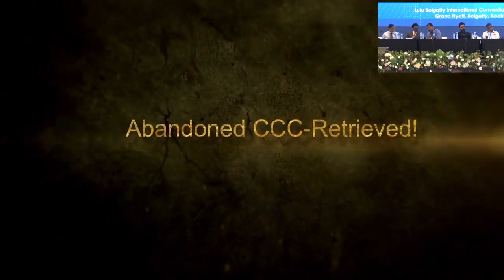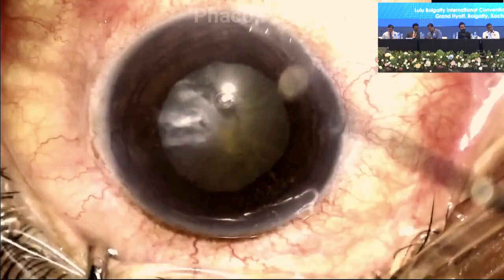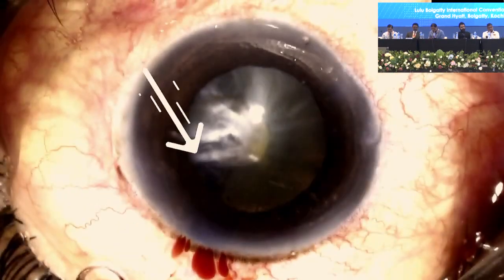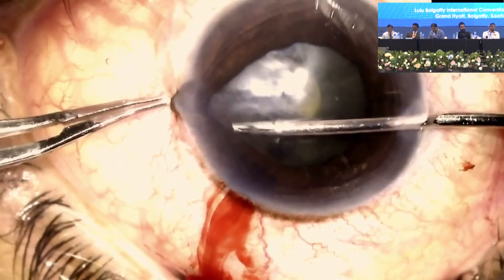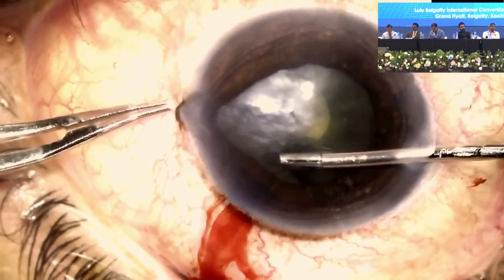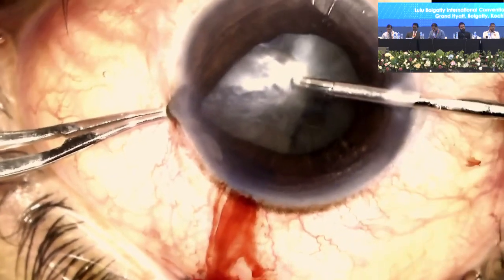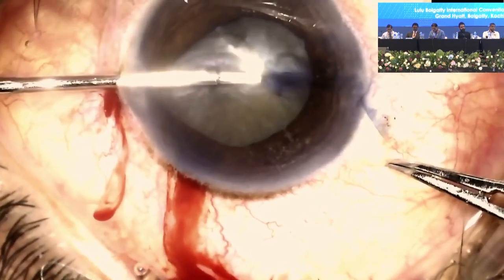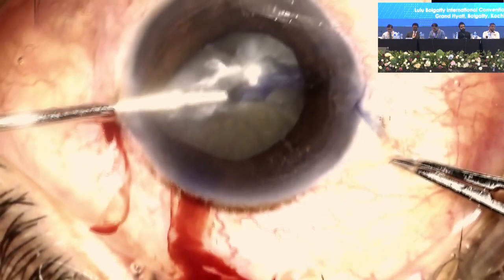This is the last case that I will discuss, which is a surgery abandoned by a previous surgeon during rhexis. And this is how he presented to us. You can see after staining the capsule, I could see the obvious tear in the anterior capsule. I held on to it with the help of a McPherson's and was able to just pull literally with some force towards the center, and I managed to convert this tear into a stable rhexis.